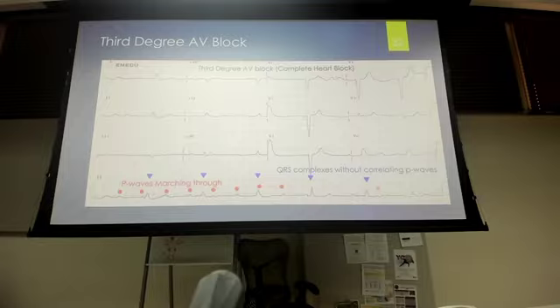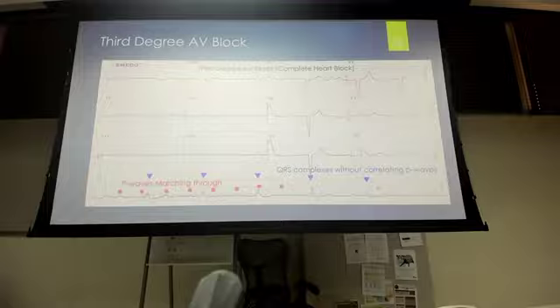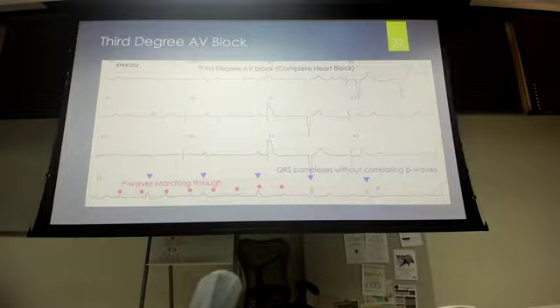So think of this again as a kind of ventricular escape rhythm, where we're not getting firing from above, so the ventricles are taking over pacemaker responsibility, right? If it was getting firing from above, our rate would be much faster, because it's going to be going with that normal SA node down to the ventricles.